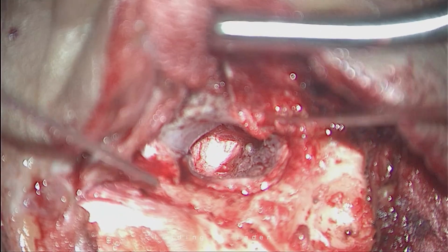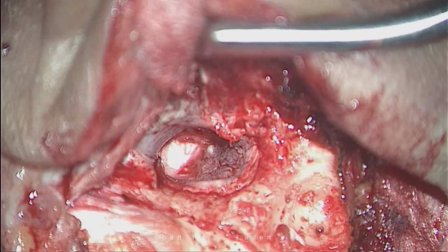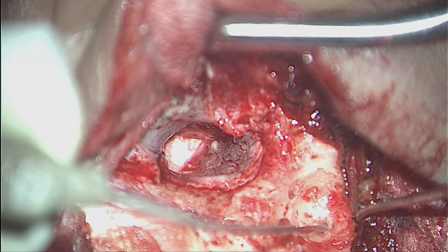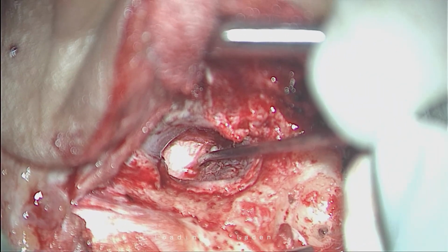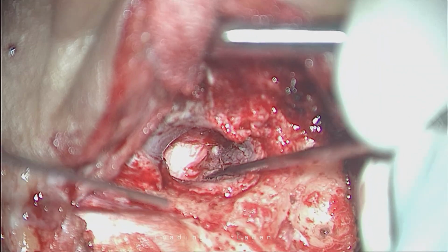And always we put a little bit of suction right anterior superior, to make sure that there is no hidden deficiency causing a residue. This is what Ashish was saying. See the movement in the graft. Yes, Satish, correct. That's the important point you noted.